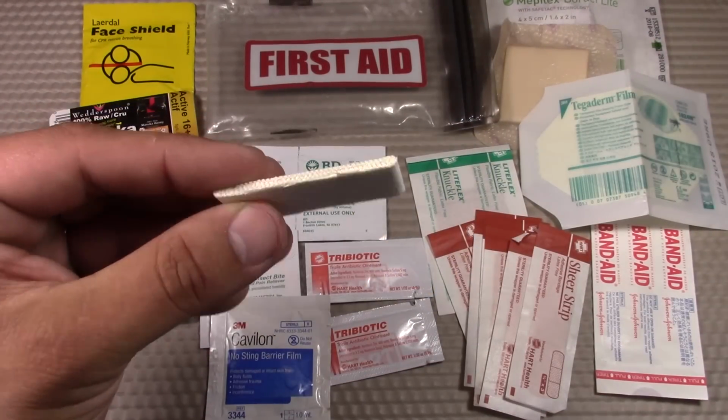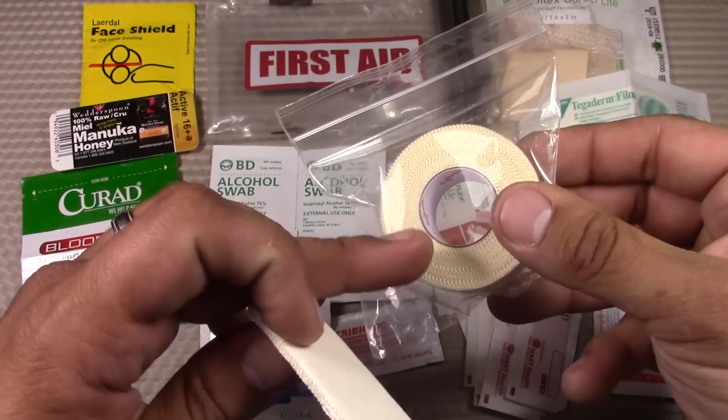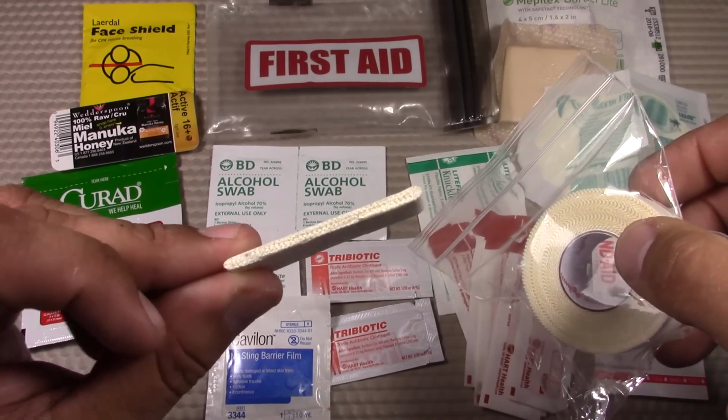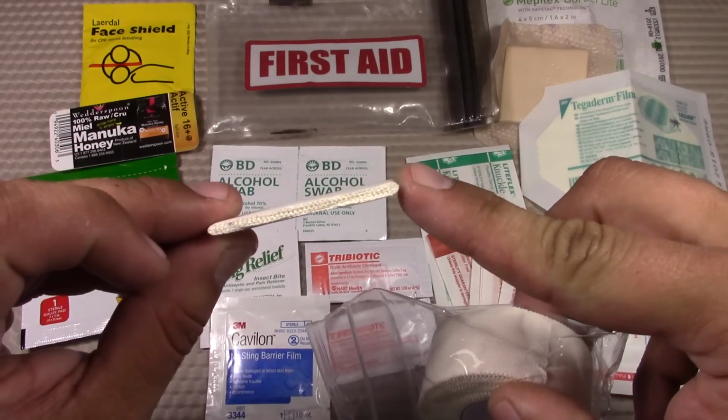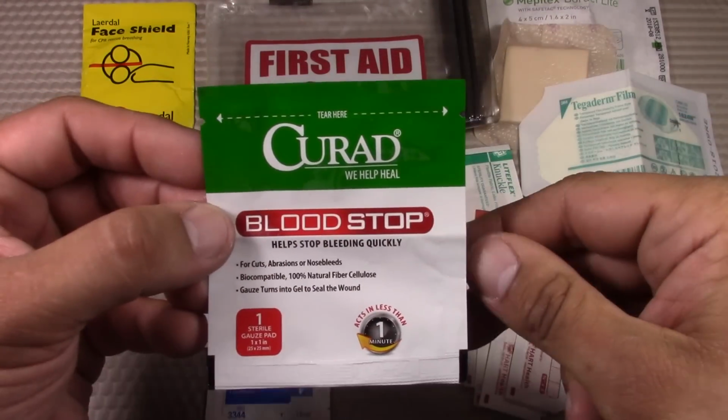Next, I have a few feet of medical tape, and this is used for various purposes, and instead of having the roll of it in there, I've wrapped it around a cut-up business card, I believe, and that allows it to be able to store flat in the Mini Medi kit. So, some medical tape. Next, we have some Curad Blood Stop.